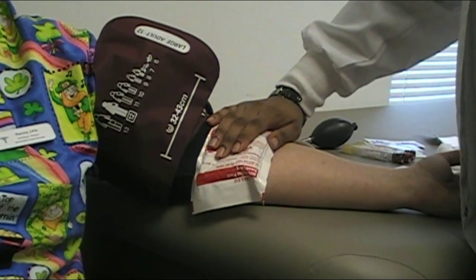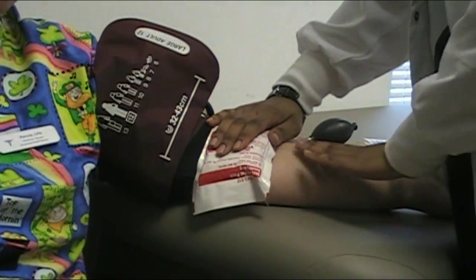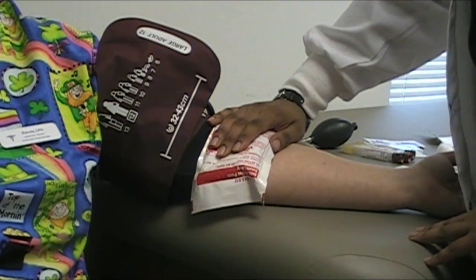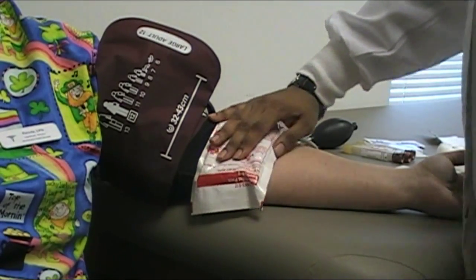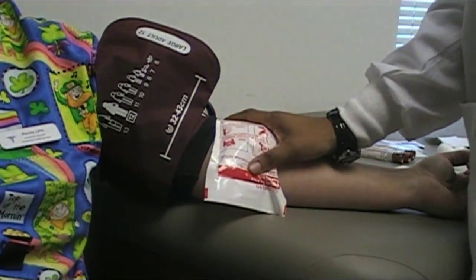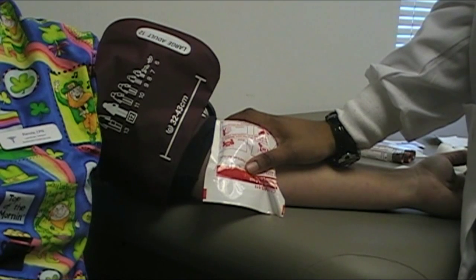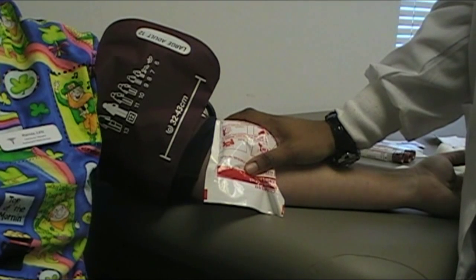We don't care about its personality — we care that it gives us some blood. One of the things you've got to be aware of with our patients is most of them are rather large, so the veins aren't necessarily right on the surface. When you're feeling for that vein, you need to feel not only that it's there, but the direction it's running and the depth. If you know all those things, you can get one lumen right inside the other lumen, and you get blood.